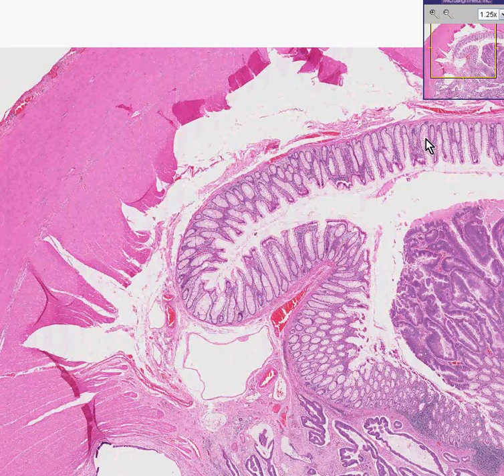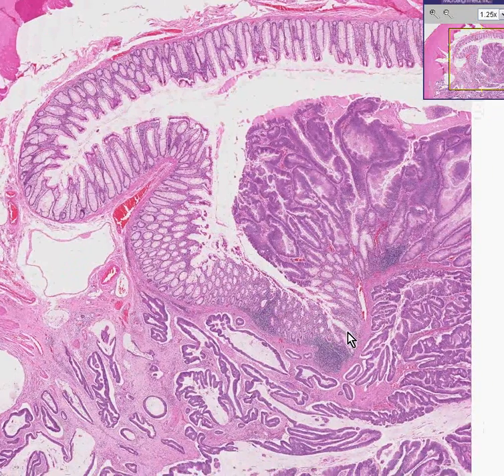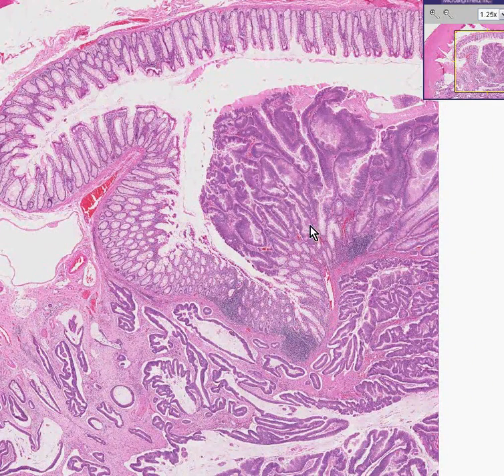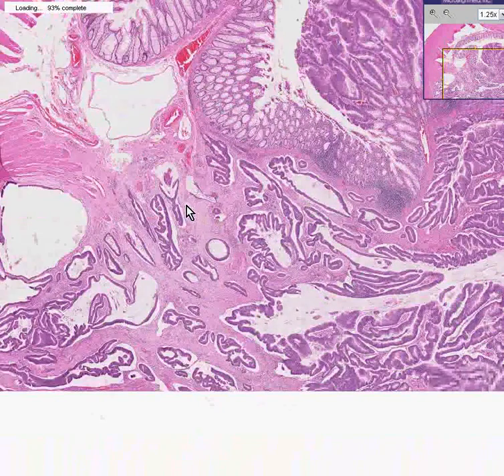Here's normal mucosa repeating across the section, coming up over this submucosal bump — normal mucosa continuing — and then all of a sudden you have a widely proliferated mucosa. And then you can see underneath that these glands have infiltrated into the submucosa.